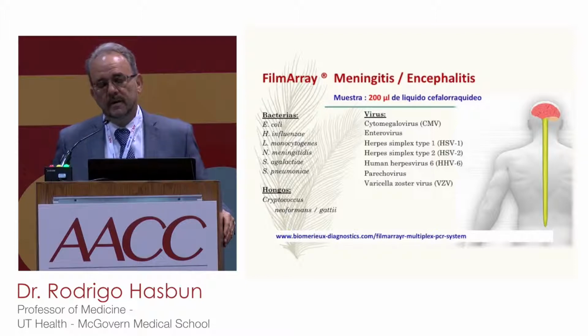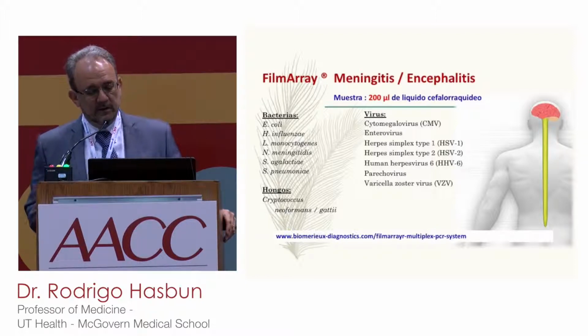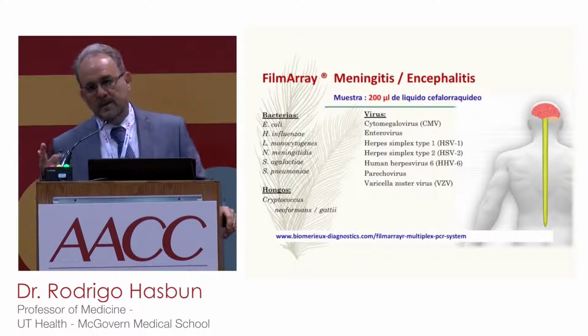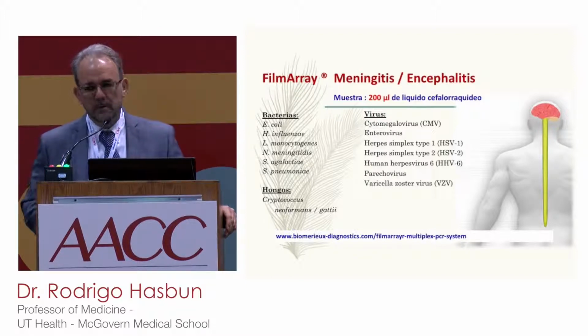So it's fast, and it has a lot of etiologies you can look at, especially some where the patient could go home, like enterovirus and parechovirus. Remember VZV, we're only checking that in 1% of our patients right now, so we could pick up more VZV.